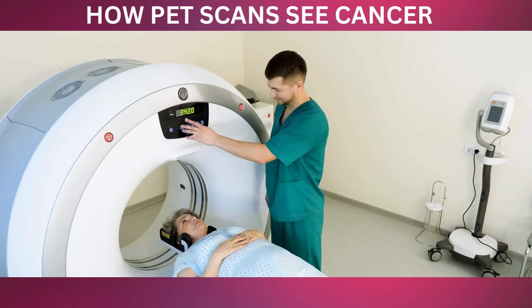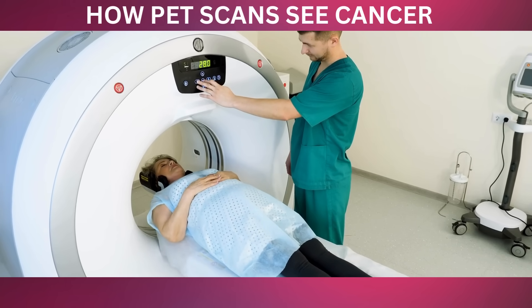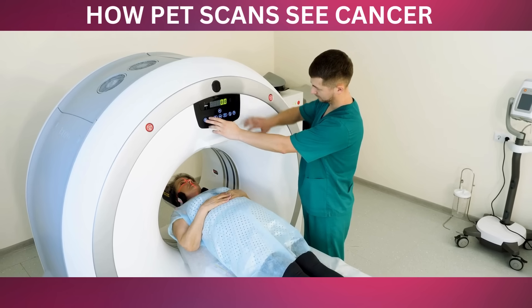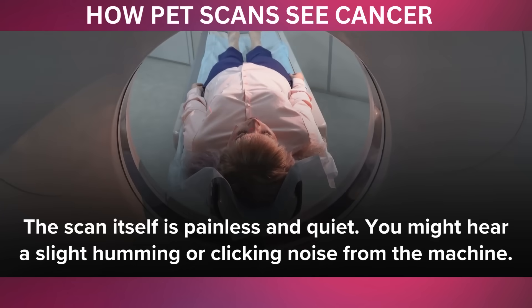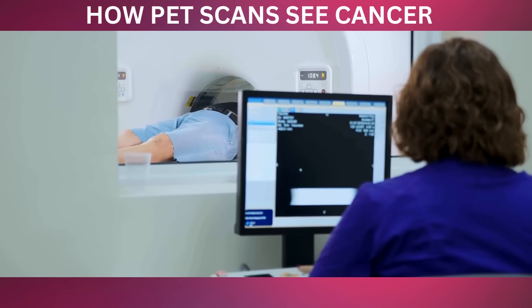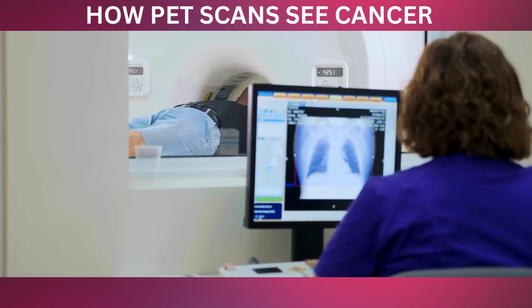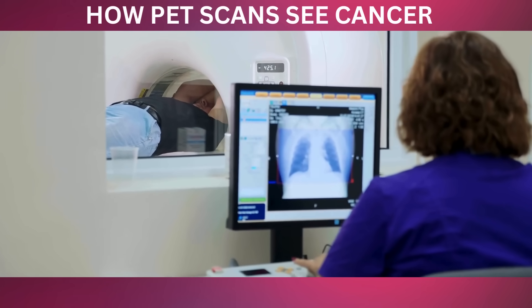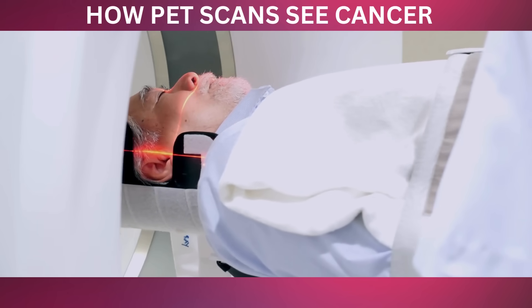When it's time for the scan, you'll lie down on a cushioned table that slides into the PET scanner, which looks like a large donut-shaped machine. The technician will make sure you're comfortable and explain that it's important to stay as still as possible during the scan to get clear images. The scan itself is painless and quiet — you might hear a slight humming or clicking noise from the machine. The scanner detects the gamma rays emitted by the tracer in your body and creates detailed 3D images. The entire scanning process usually takes about 30 minutes to an hour.